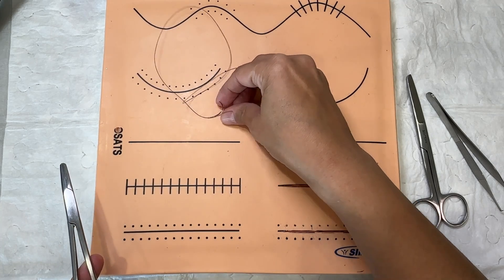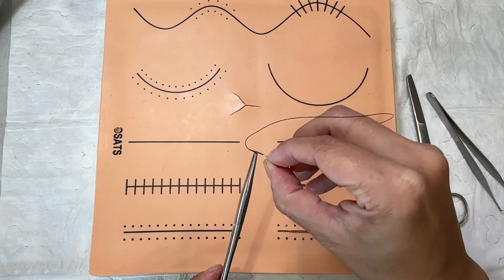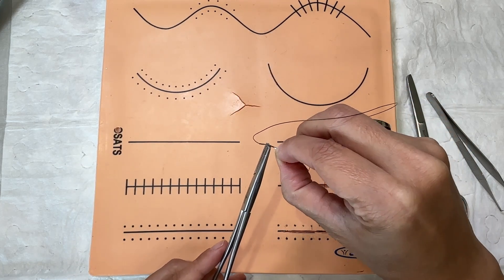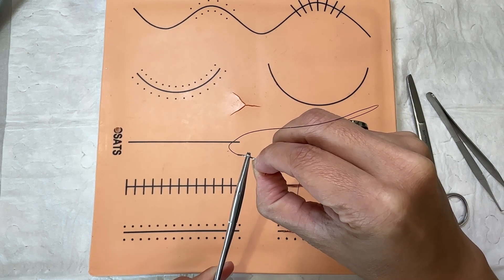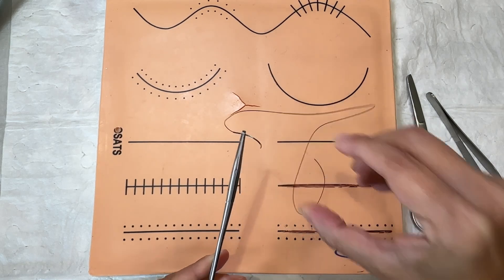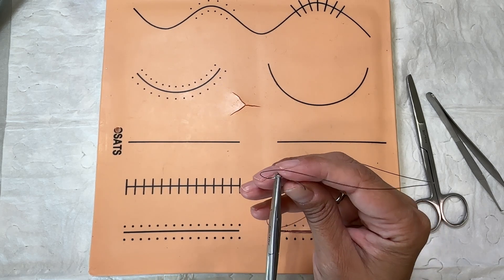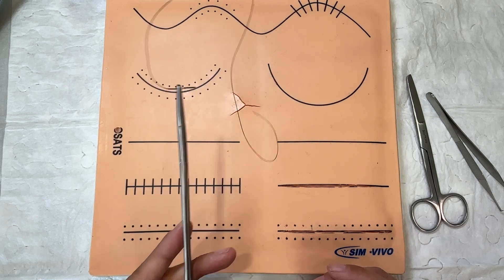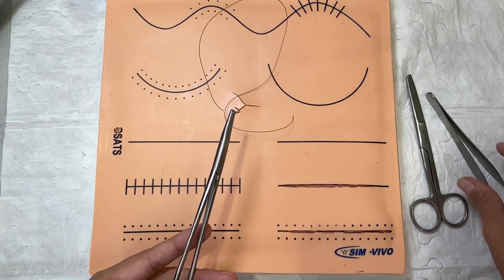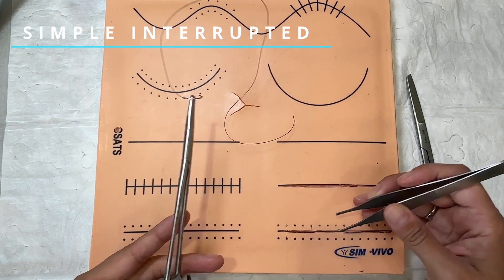I'm going to grab my needle with my right hand and find the last little third of the needle, then grab it with just the tip of my needle driver and lock it — I usually lock it twice. Always load your needle perfectly; if your needle's not loaded perfectly, it's going to be hard to do the stitch. Now I'm loaded up — I'll grab my forceps with my right hand and work down on the suture pad.